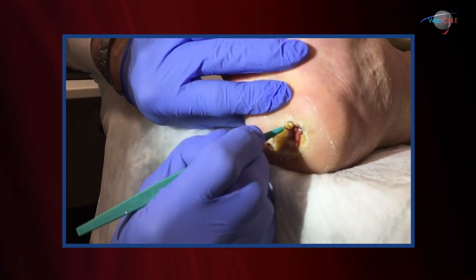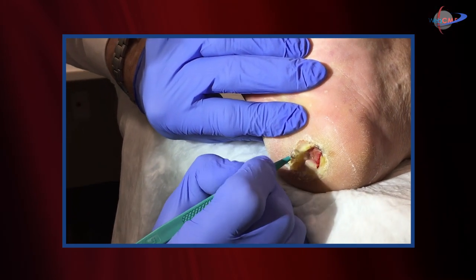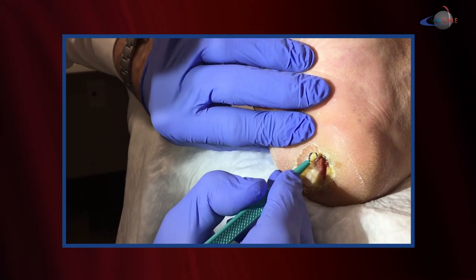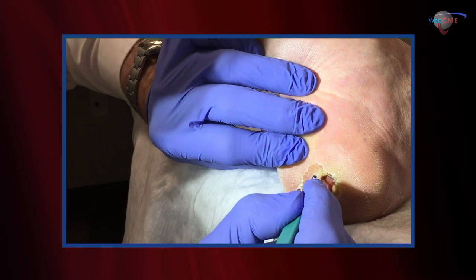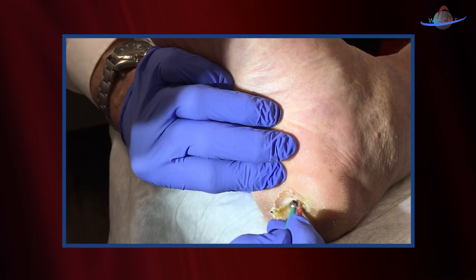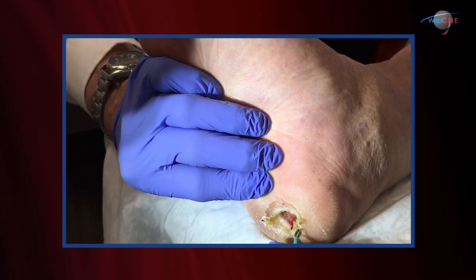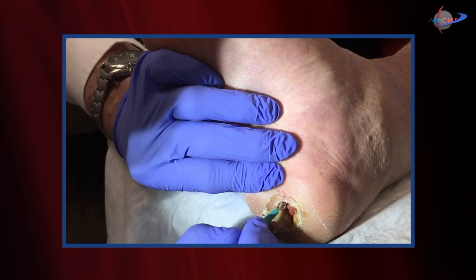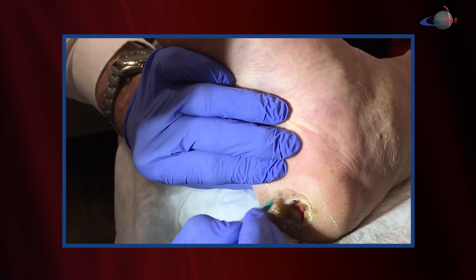Taking my favorite tool — the curette — and we're going to come through that very thick callus. You can tell that this margin will never heal in its current fashion. That tissue will not allow epithelization across the wound base. We need to saucerize this, get rid of those callus margins, and get down to a plane of healing that will facilitate epithelization of the wound base.